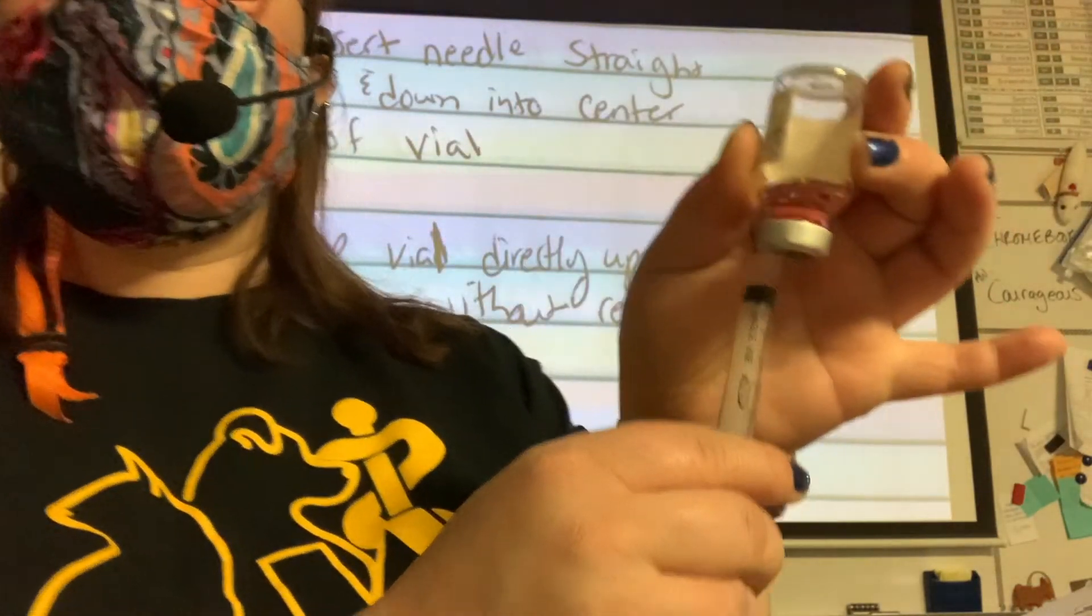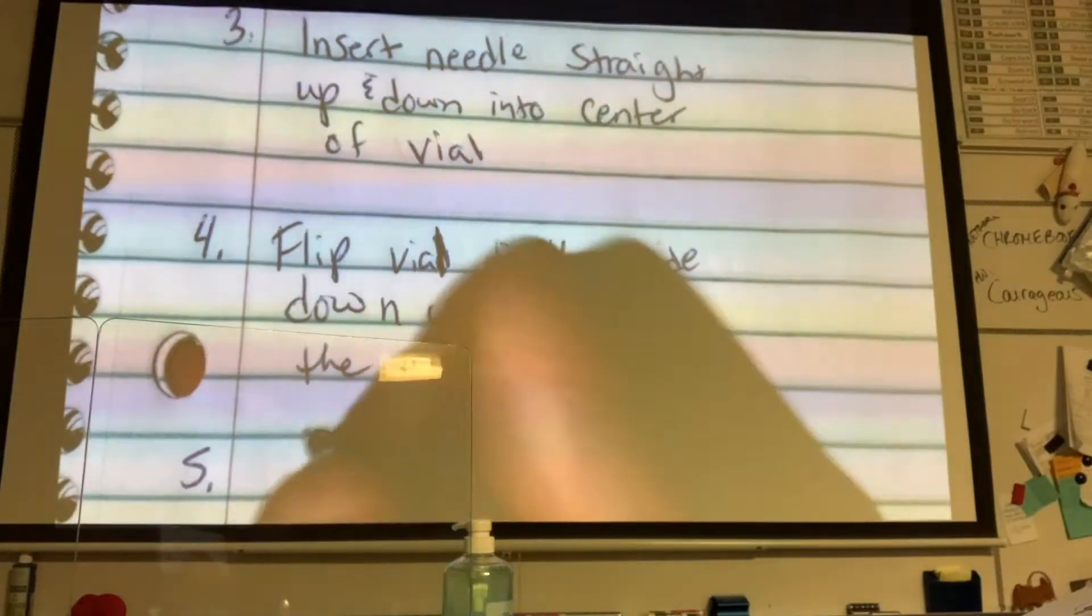Five. The student withdraws the proper volume. So cool. I'm in accordance. I'm all about this. So it's up and down. I'm going to withdraw the proper volume. I'm going to change it slightly. So we are going to draw up desired amount or the proper volume plus some. Draw up desired amount plus some.